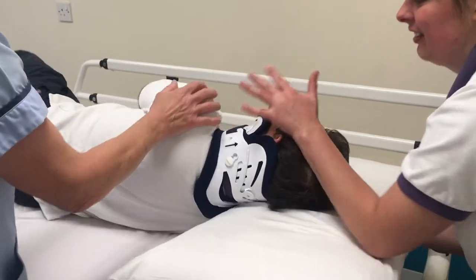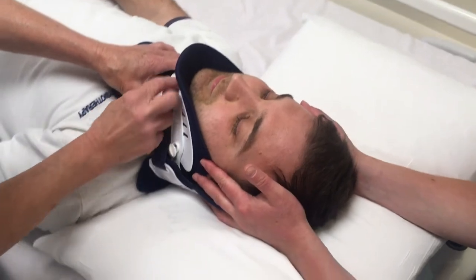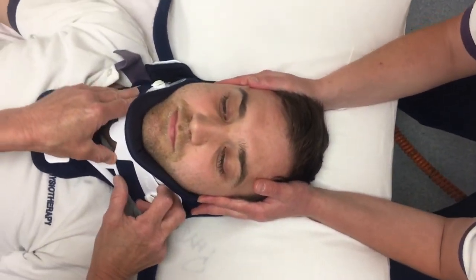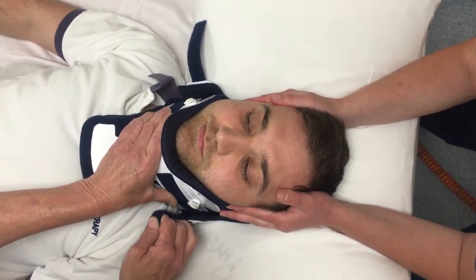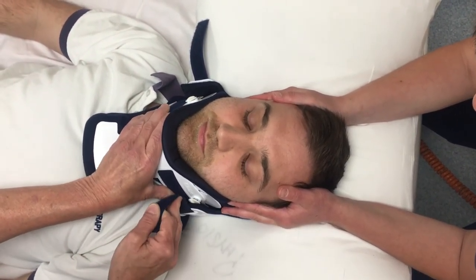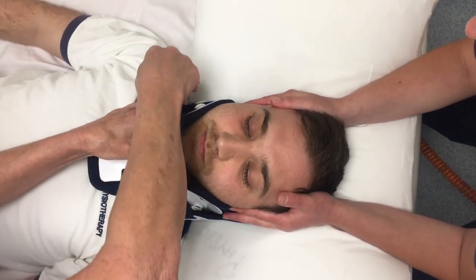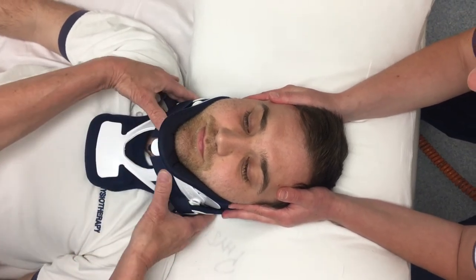Bring the patient back over onto his back and make some final adjustments to the collar, making sure that it's supporting the chin. At this point you can check that the buttons haven't moved, and get a nice horizontal grip with equal overlap with the velcro.